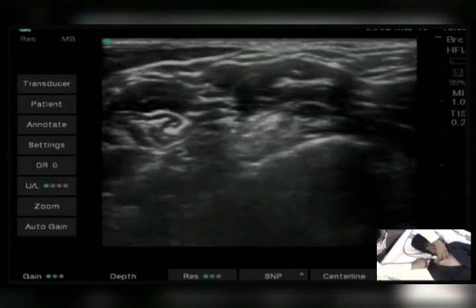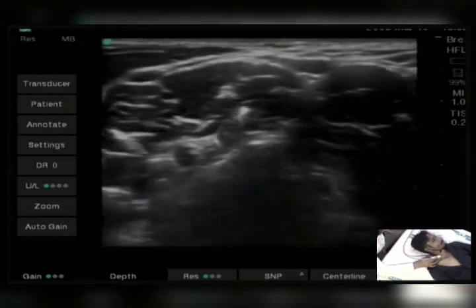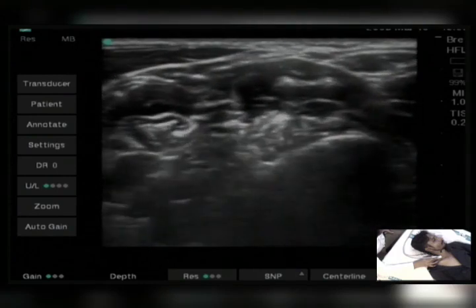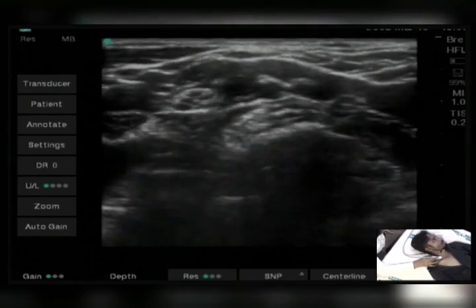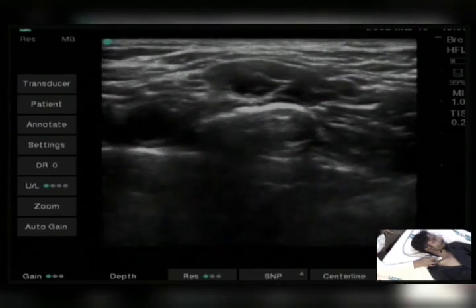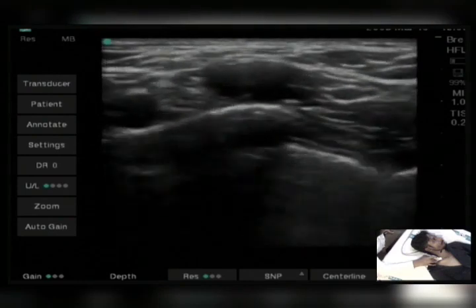So I generally utilize the probe like this, and I will enter from lateral to medial and target the C5 and C6 roots. Let's see the superior trunk, how the superior trunk is formed. So this is C5 and C6, which will join later on, and they form the superior trunk. And if I go caudally, then this superior trunk will give origin to the suprascapular nerve, which lies mostly on the lateral part, and the anterior and posterior divisions. Not very well visualized over here.